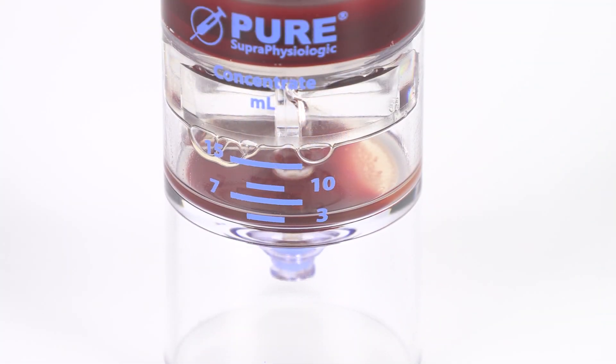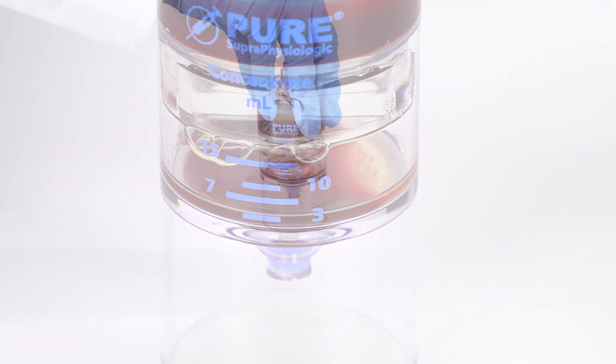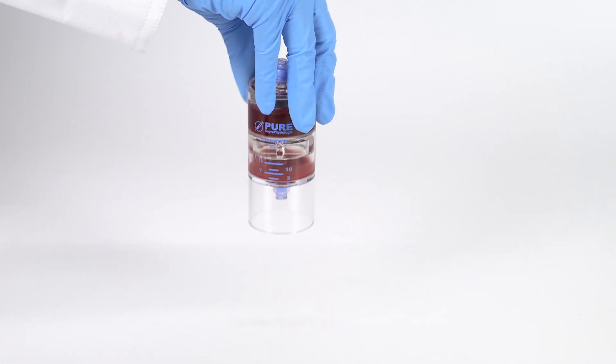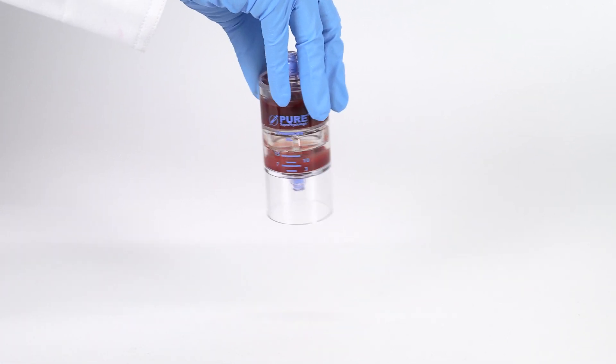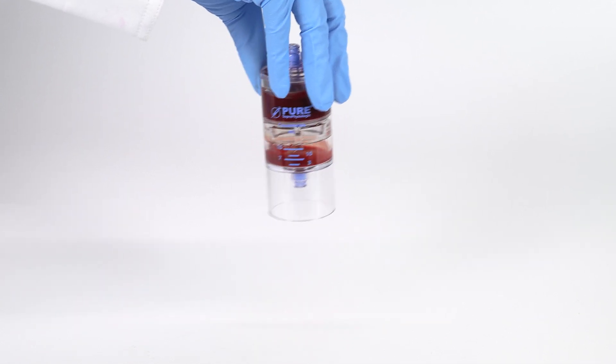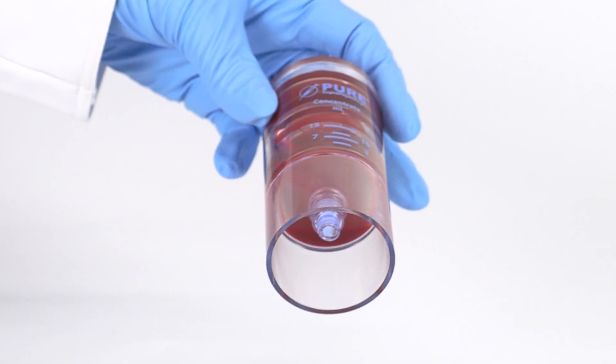The bone marrow buffy coat layer will be clearly visible at the bottom of the device. Resuspend the cell concentrate back into the plasma by rocking and swirling the device back and forth. Do this until all of the concentrate have been re-suspended into the plasma and is no longer visible at the bottom of the device.